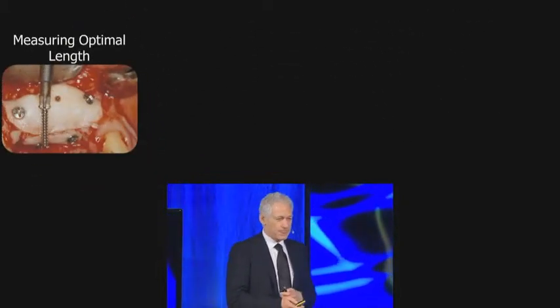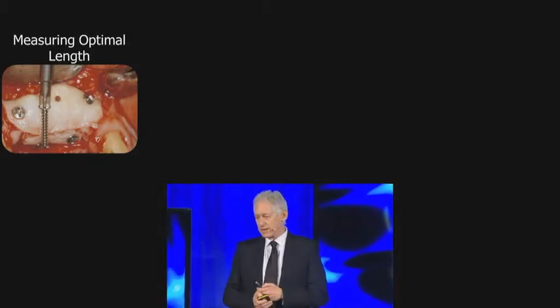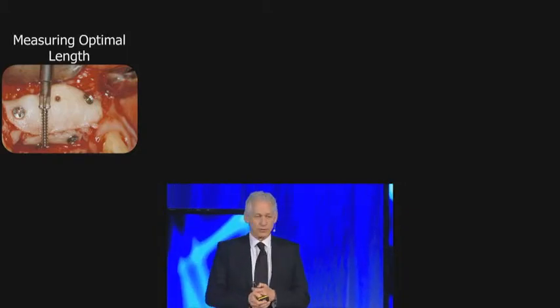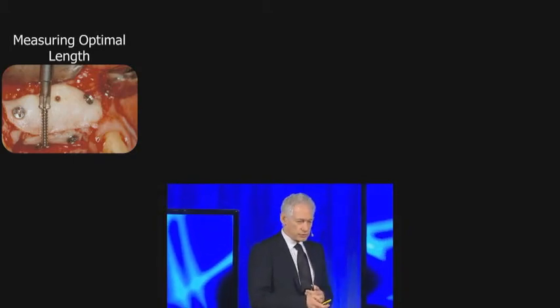Fixation screws work very well. You have to measure the exact length. If they're too long, they will interfere with orofacial movement. There will be early exposure, and you're going to lose some bone. They're going to get loose. So measurement is extremely important.